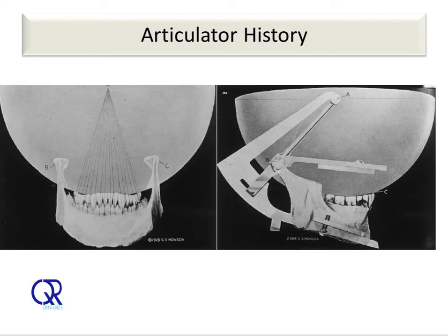Because of the way in which the mandible develops, Monson further believed that it would be logical to adapt Bonwill's 4-inch equilateral triangle to the surface of the 8-inch sphere, because geometrically, such a spherical-based triangle would also be a segment of the 8-inch sphere and the apex of an erected pyramid.